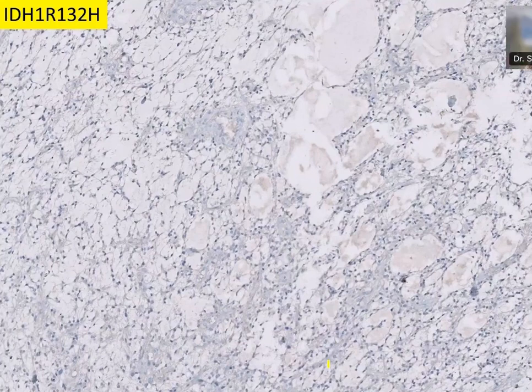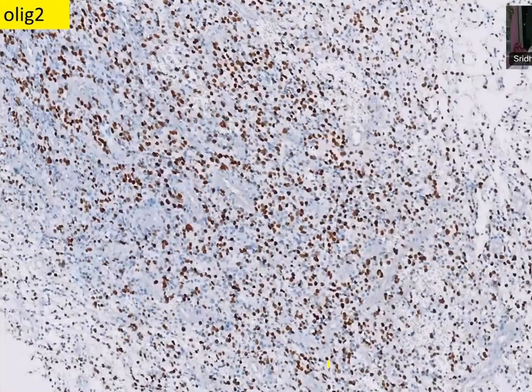Sir, it is negative. It's negative. So this is OLIG2, which is showing some positivity. Yes, sir. Okay. So it tells you that it's a glial tumor only. Yes, sir. So this is ATRX.